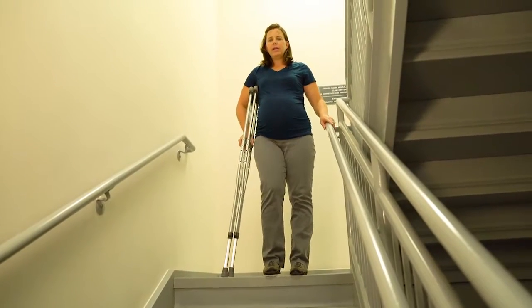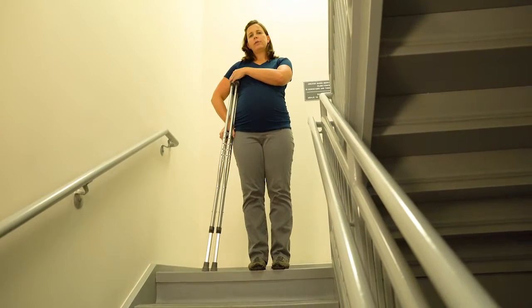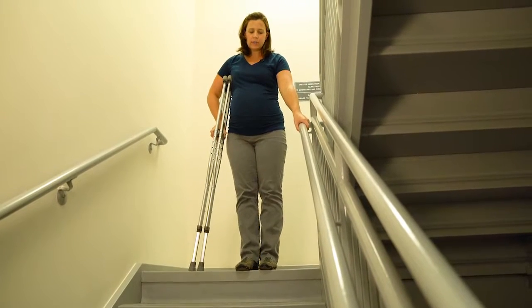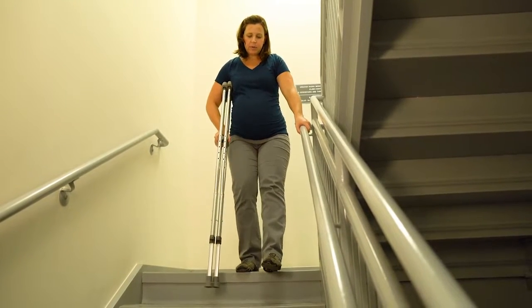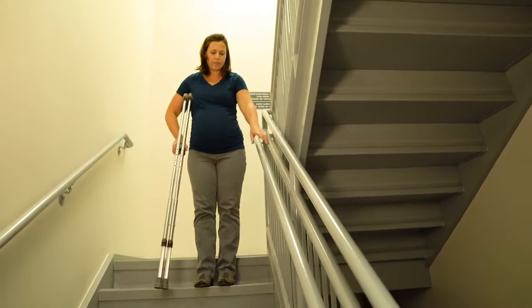If you have a railing, be sure to use it. Again, you can put both crutches together over on the same side or have someone hold one of the crutches for you. Hold onto the railing. Still step down with the crutches and the affected leg first, followed by your good leg.